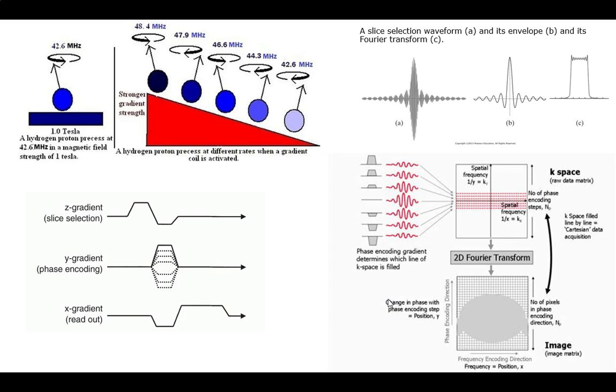Think of this as spinning your top in the first place. So I kind of encode this Z field just so I start one slice and one slice only to start spinning. And it's done by a combination of this Z gradient and the RF. And that's why I said they work in concert.